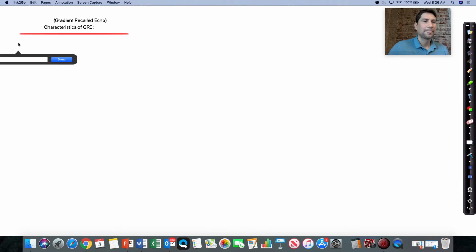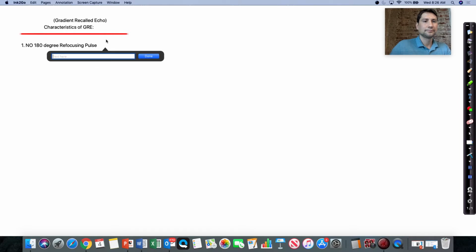All right. So the first characteristic is we have no 180 degree refocusing pulse. An advantage of that, we can reduce time.